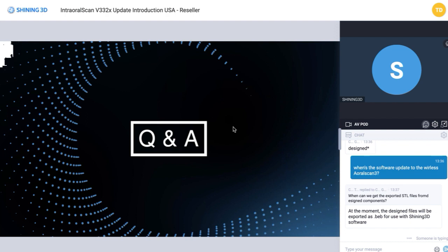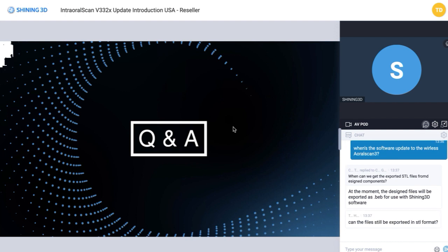So I believe the software update should be released next month at some point. So yes, the scanned files, the actual scan itself will always be able to be exported as STL files. The items that can't be exported are the design modules, like the temp design, as well as the splint design. Those will only be printable with our printers for the time being.